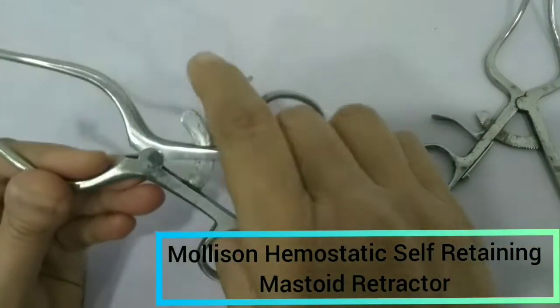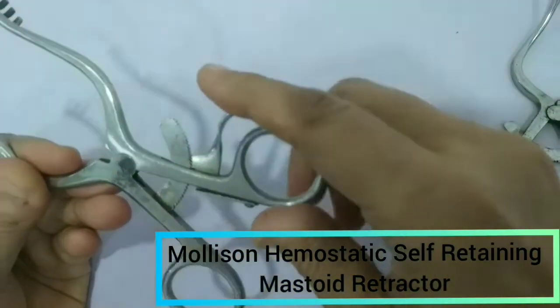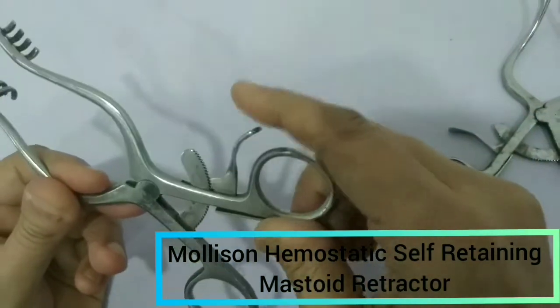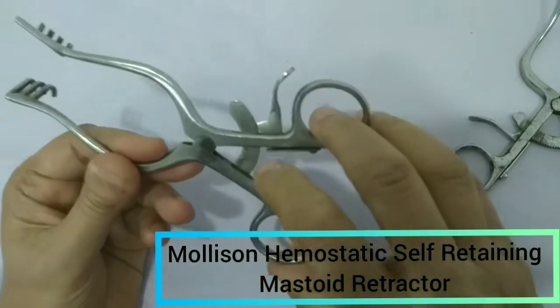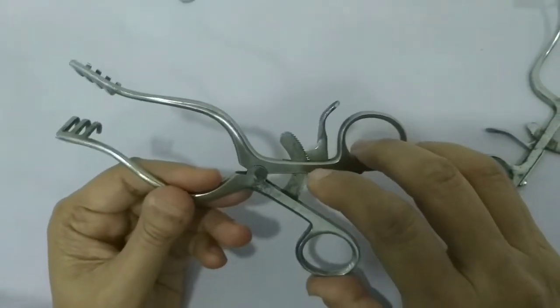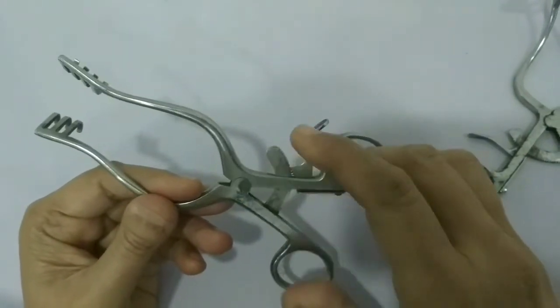It is called self-retaining because once we open it, it will not close by itself. You can see this lock arrangement — if we wish to close it, we press this and then we can close it. Once it is released, it will not close by itself. It also controls the bleeding, which is why it is called hemostatic, and it is used for mastoid surgery.